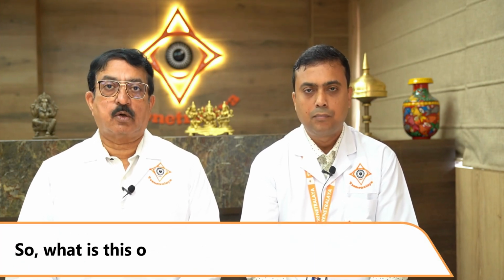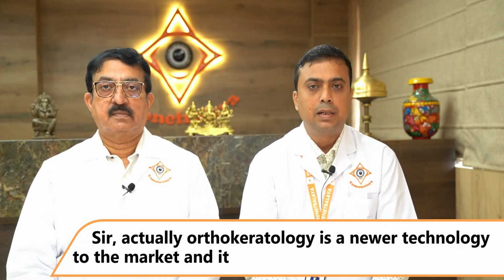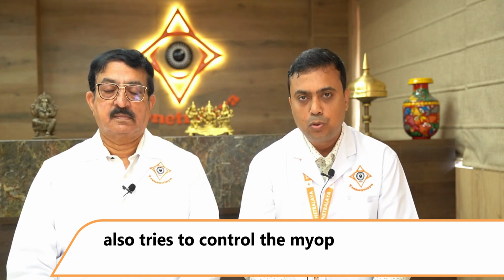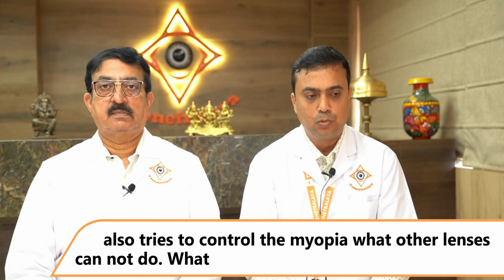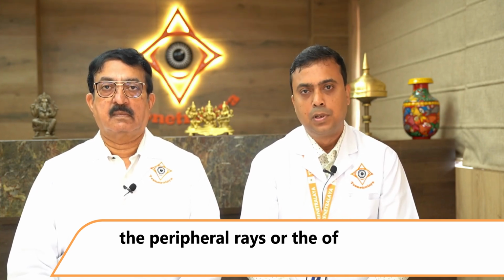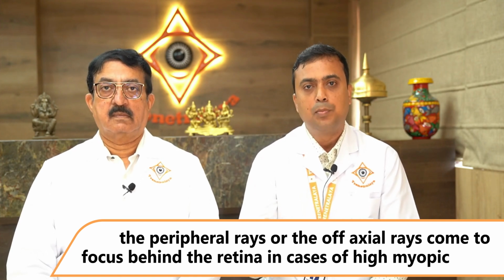Now, Prajjwal, what we have seen is that orthokeratology has become a very, very important aspect in our armamentarium. So what is this orthokeratology? Actually, orthokeratology is a newer technology to the market, and it not only corrects the myopia but also tries to control the myopia, what other lenses cannot do. What we have seen in the research is that the peripheral rays or the off-axial rays come to focus behind the retina in cases of high myopic kids.